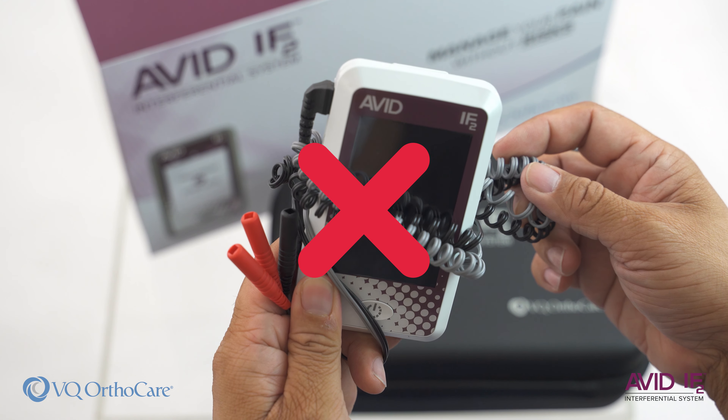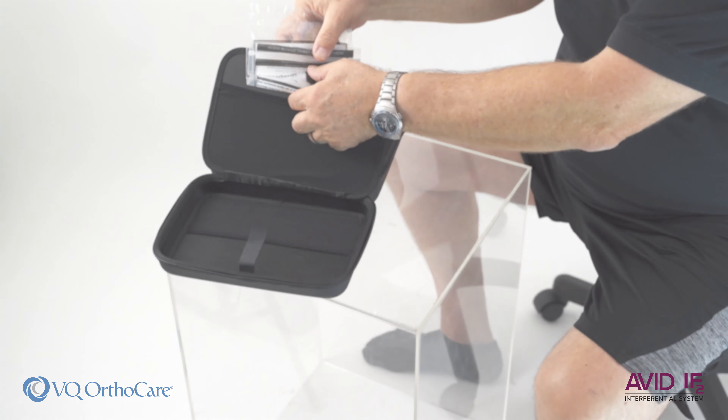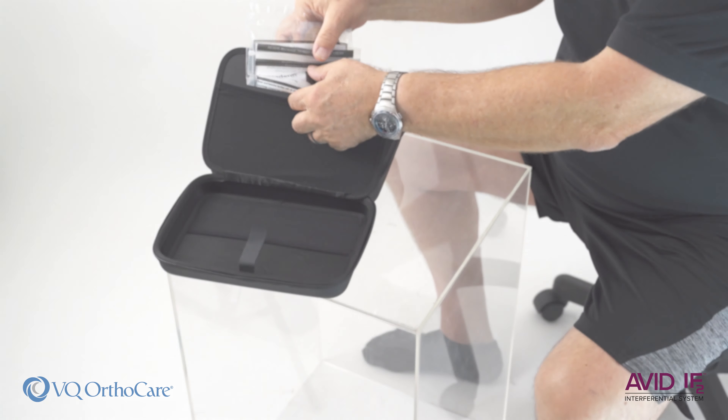If there is any gel residue from the electrodes on the skin, use the adhesive remover wipes to remove it. Disconnect the lead wire when not in use and place the device and lead wires in the carry case for safekeeping.